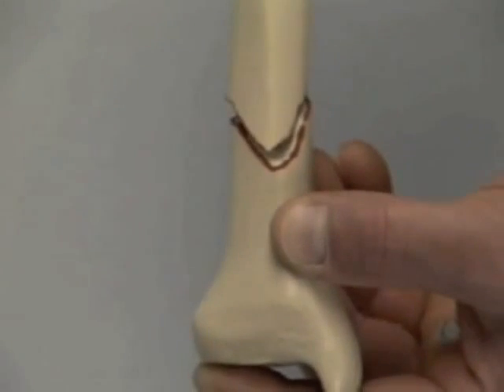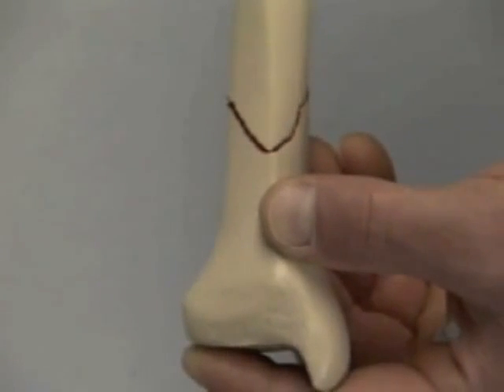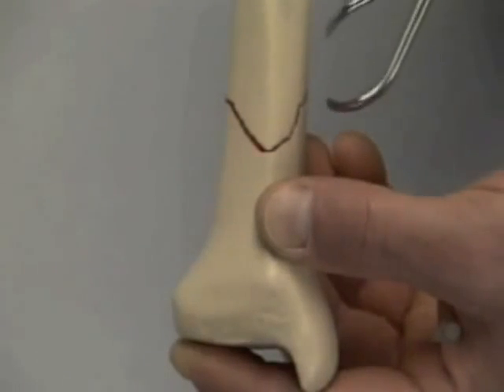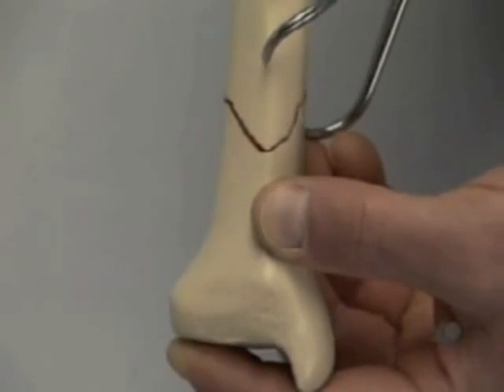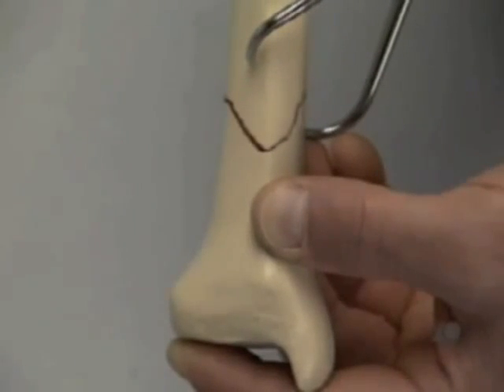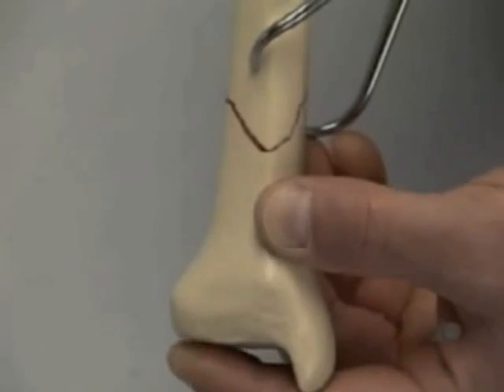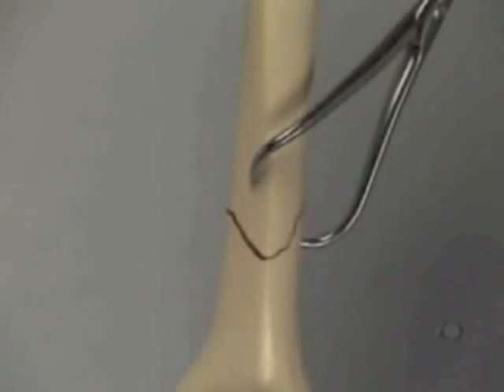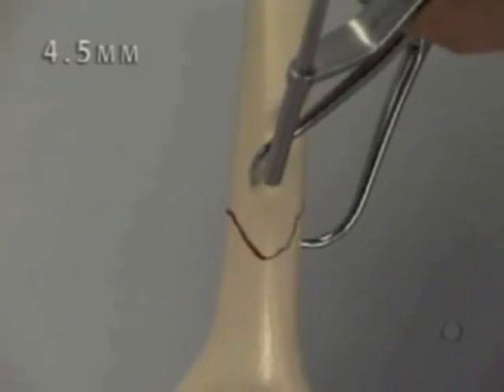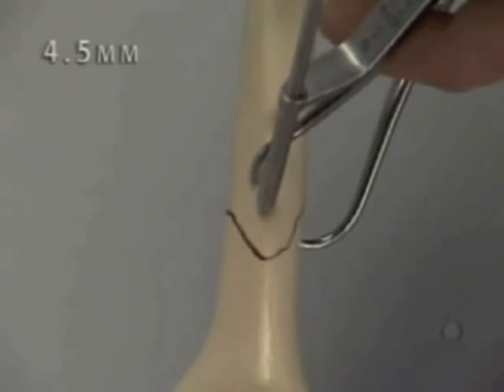The short oblique distal tibia fracture is anatomically reduced and held with the pointed reduction forceps. As the first step, a 4.5 millimeter lag screw is inserted in the AP direction.